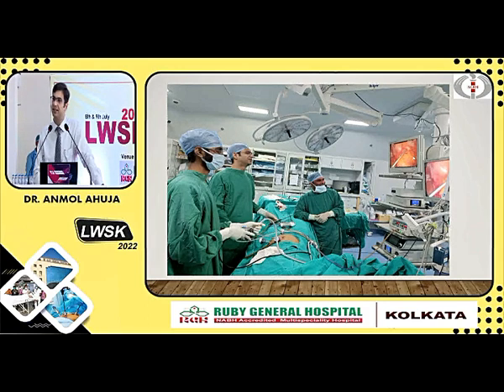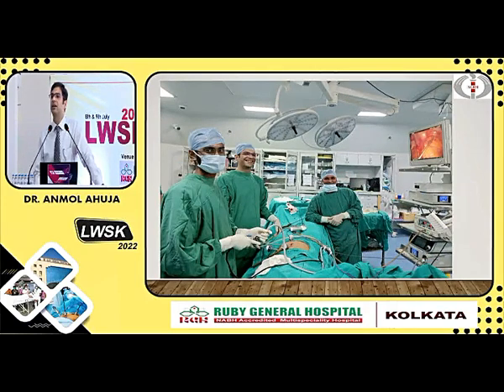See, these are the 2 monitors here. Please don't mind that I am not wearing a mask here. This monitor is very high up, so it is not to be used. This is our secondary monitor, we don't use it. This is the monitor, and from my height, it comes below my eye level. All my arms are extended at the elbow. The patient table is quite down, head is down, right? And that is why all of us are having a good time. We were operating at 2 o'clock in the morning. So this should be your outcome. Once you are performing a laparoscopic surgery, everybody should be happy, including your assistant and your anesthetist.